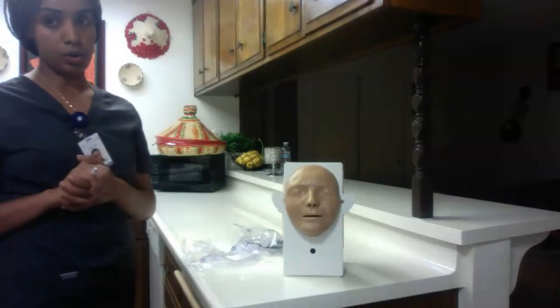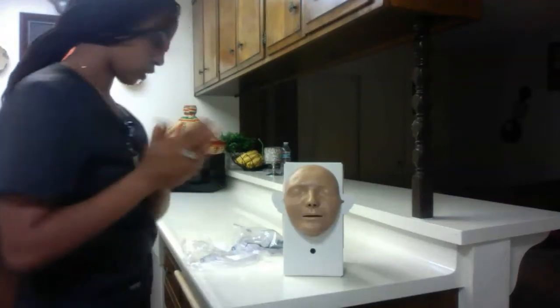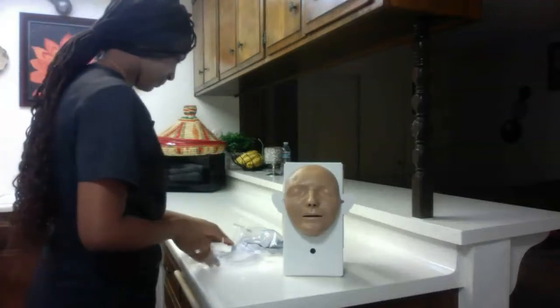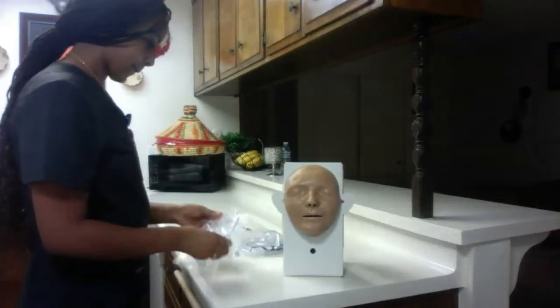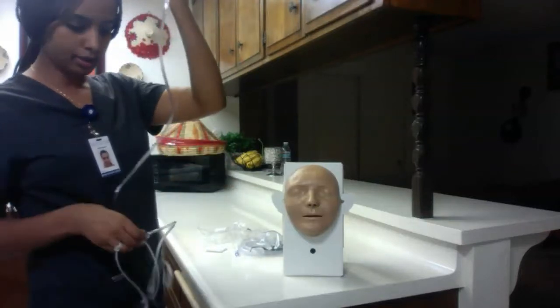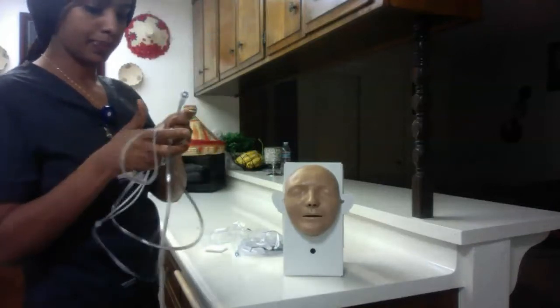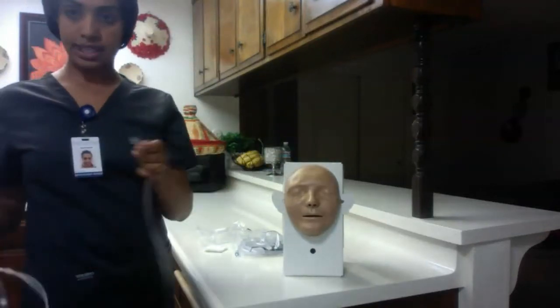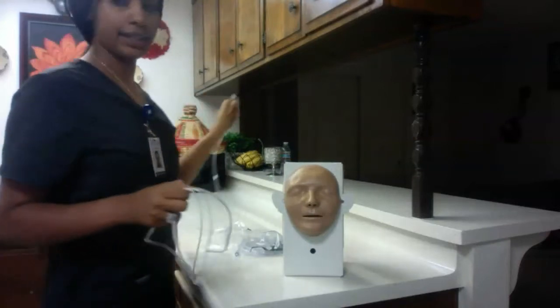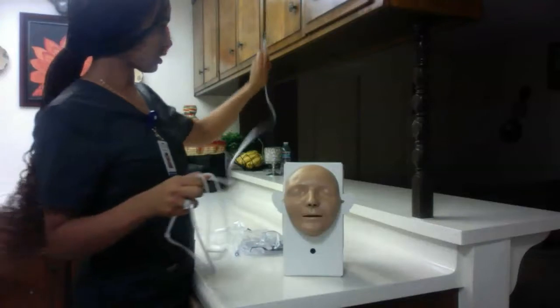I'm going to wash my hands before I start new patient care. Here is my nasal cannula right here. I'm going to take this and plug it into the oxygen source. Okay, so we'll pretend I plug it into the oxygen source.